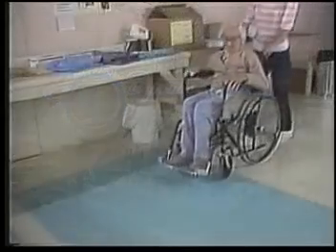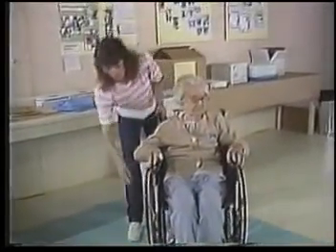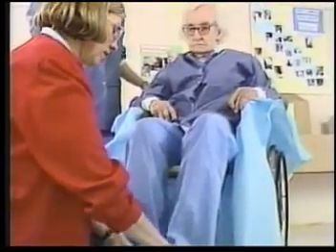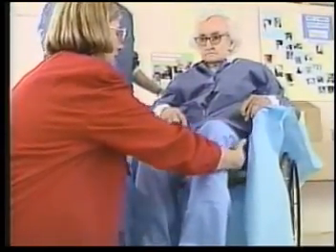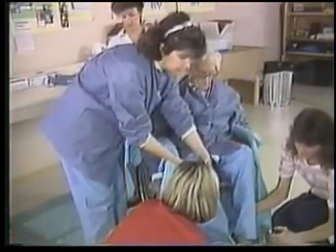The person to be molded today is an elderly woman who needs improved pelvic positioning and lateral support. Trial positioning is essential for a successful molding. Trial positioning will familiarize each member of the team with their duty. It usually takes 2 people to transfer, 1 to mix, and 1 to hold the bag open.